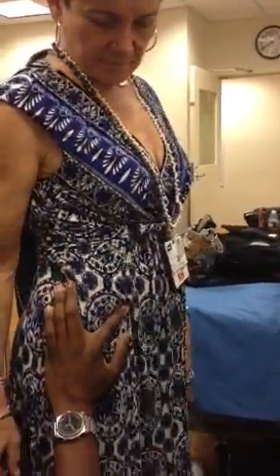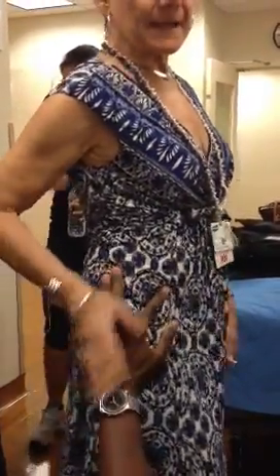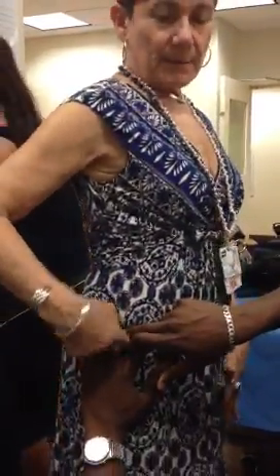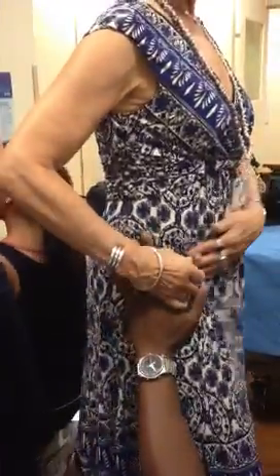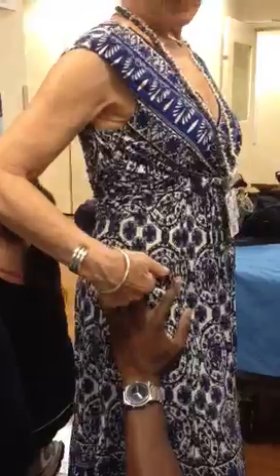Okay, all right. And so my injection. Is your hand still on the trochanter? If your hand is not on the trochanter, you're going to be too far up and you're going to give it in bone. Yeah, feel with the other hand. Those are your landmarks. Palm on the greater trochanter, this on the anterior iliac spine, this on the crest, or towards the crest.